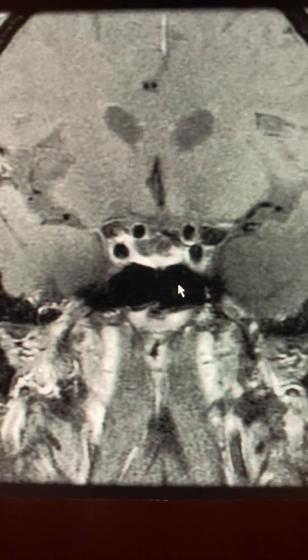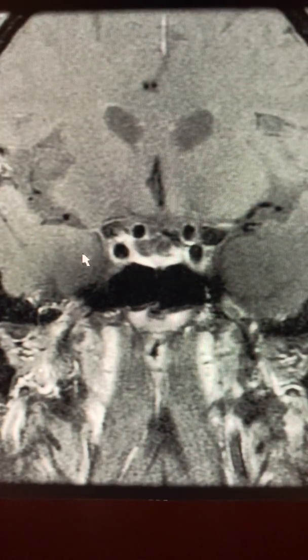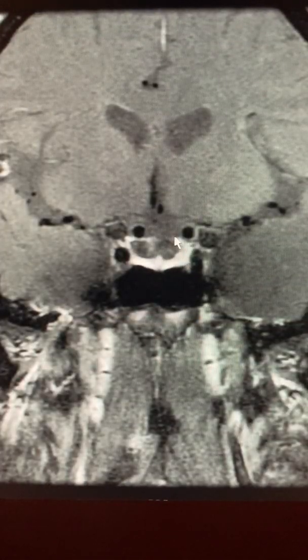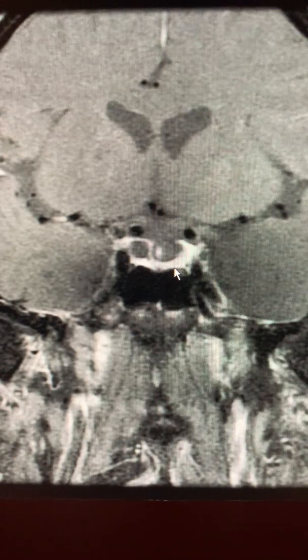This black space below is the sphenoid sinus. Here are the temporal lobes of the brain. Again, this is a very abnormal looking sella. Things start to really clear up and illustrate what's going on here. You can see this area looks like a cyst, and probably is a cyst.